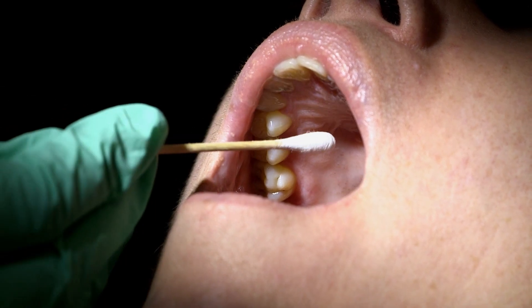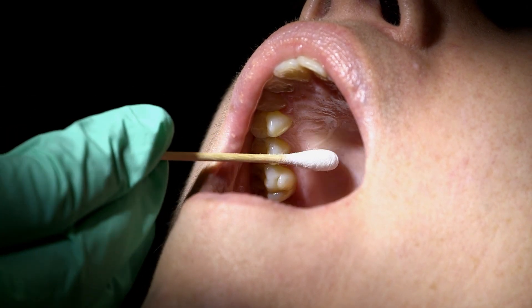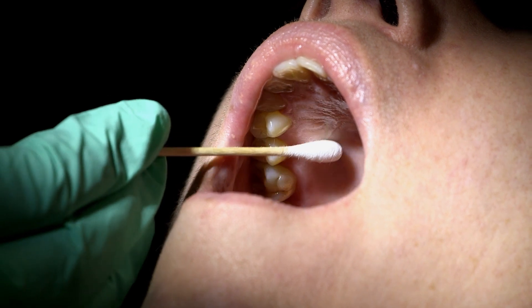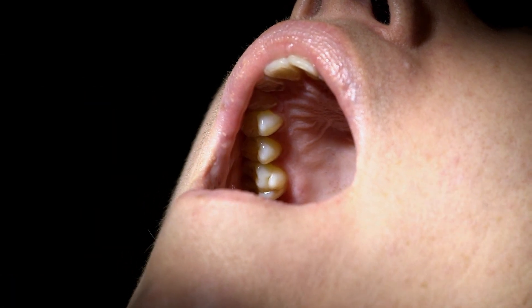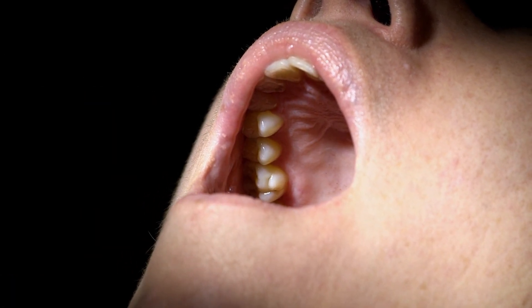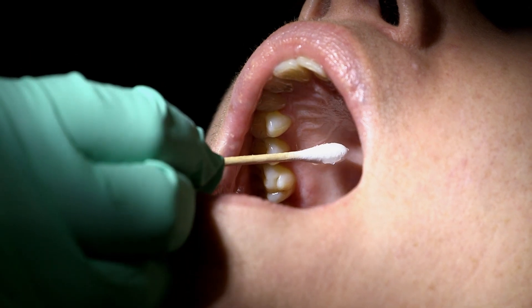Before administering the injection we will apply topical anaesthesia. We will firstly dry the tissues, then apply the topical for 1-2 minutes.